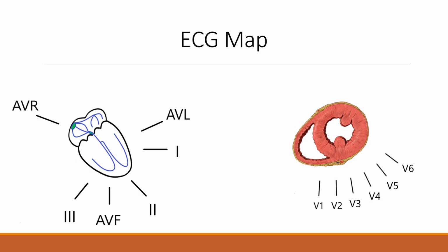And there's so many other things. If a patient has left ventricular hypertrophy, well, guess which leads are going to be the biggest and the most upright? They're going to be 1 and AVL. Why is that? Because they look at the left side of the heart, and that's where the energy is producing. If you have a left axis, your QRS complex is going to be the most positively deflected in AVL. Why? Because the energy is traveling in that direction. And again, I could go on and on.